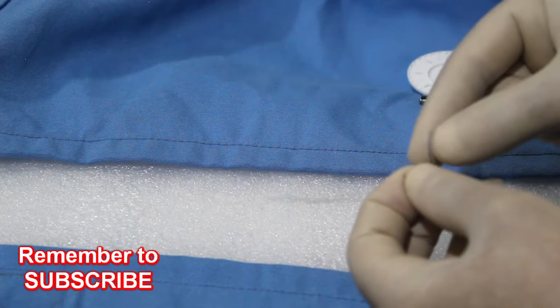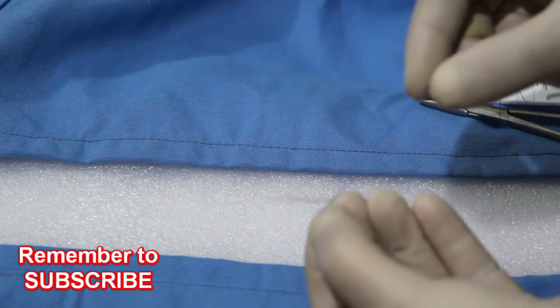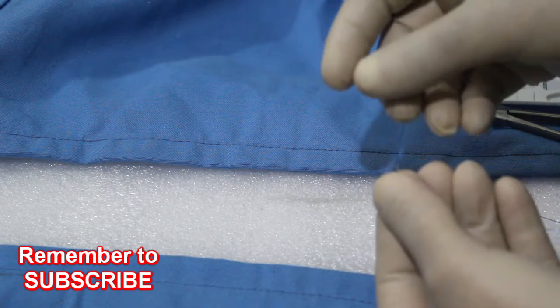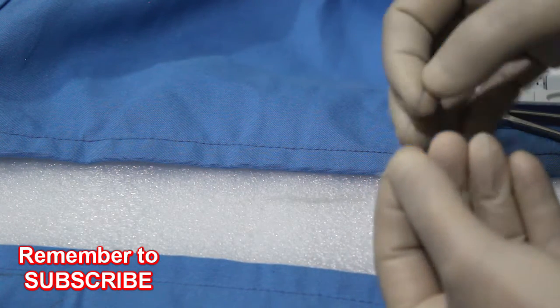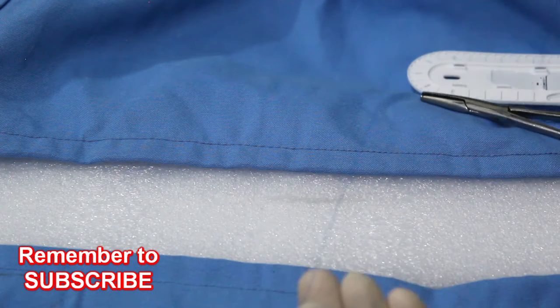The thread should be stretched gently after it has been removed from the primary packet. Always hold it like this and stretch it. Don't pull it sharply — if you do, the thread will break from the needle and become useless. Hold it correctly and then stretch it.